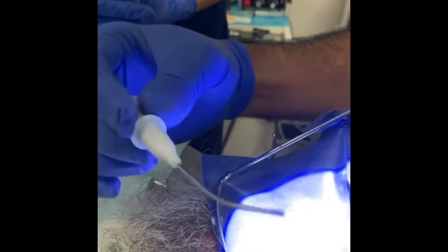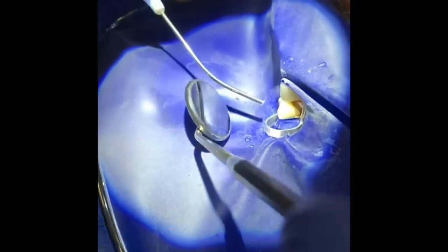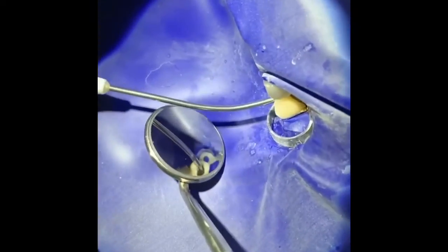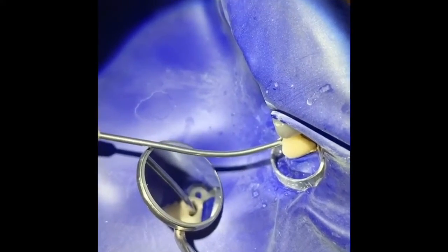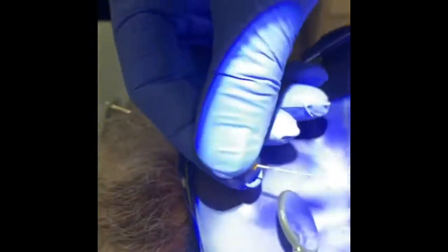Because my master apical file is more than 50, this is the MTA carrier — there's MTA in there. I'm gonna use a couple of them. This is my size 50, that's my master apical file.